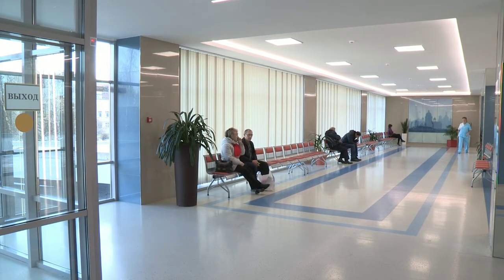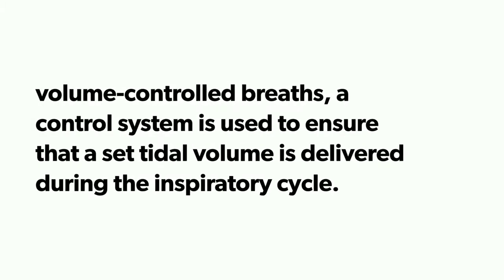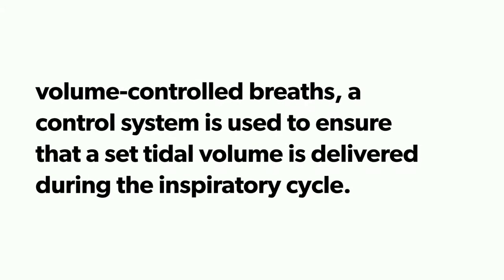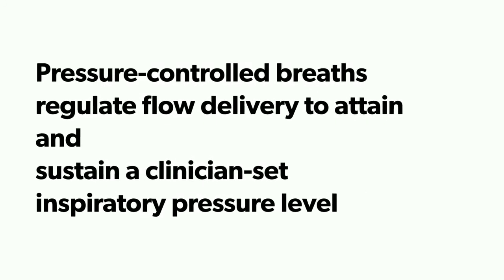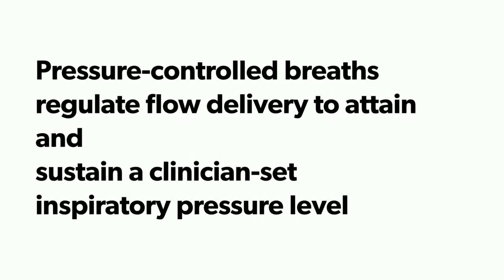So in volume control breaths, a control system is used to ensure that a set tidal volume is delivered during the inspiratory cycle. In the case of pressure control breaths, the system regulates the flow delivery to attain and sustain a clinician-set inspiratory pressure level too.